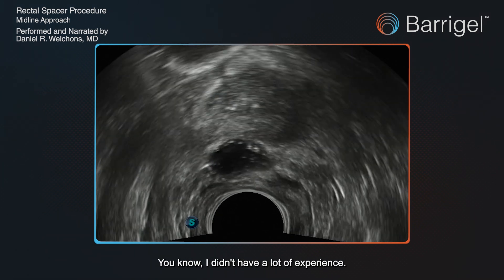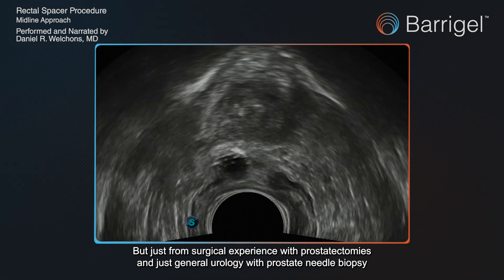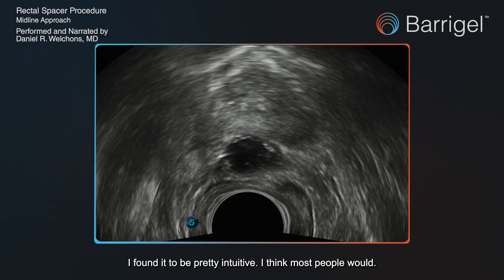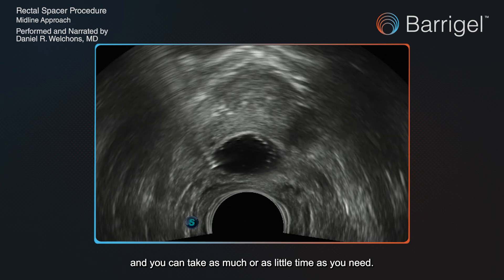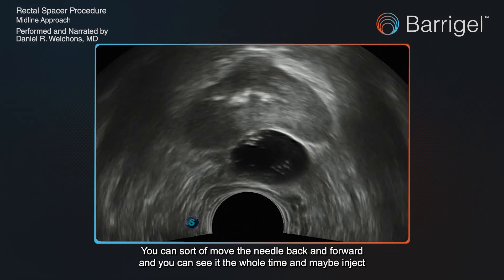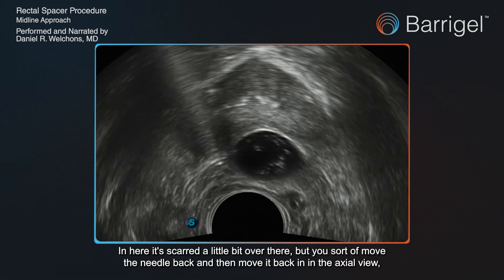A lot of this is intuitive. I had no experience with a transperineal approach or with spacing, but just from surgical experience with prostatectomies and general urology with prostate needle biopsy, you can use that to develop these spaces — using the needle to direct where the gel goes. I found it to be pretty intuitive, and I think most people would. The best part is that you have control throughout the entire process and can take as much or as little time as you need. Over here I want to add a little extra gel, so I'm moving into that space and feeling whether there's resistance, moving the needle back and forth while visualizing it the whole time.